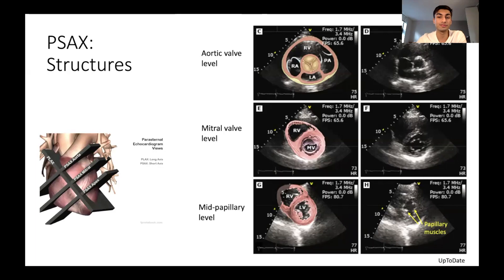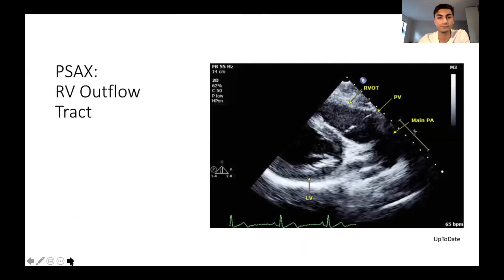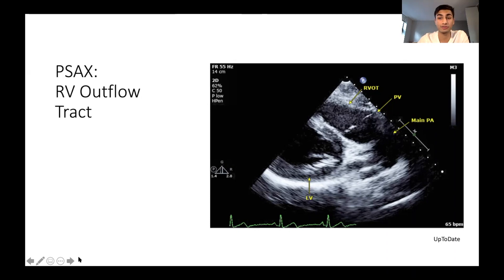Moving into the parasternal short axis views: first, at the aortic valve level — more towards the base of the heart — we're able to visualize different structures, with the important one being the aortic valve. Then at the mitral valve level, we can see where the mitral valve corresponds. At the mid-papillary level, you're able to visualize the papillary muscles. One other important view with the parasternal short axis is the right ventricular outflow tract, which is important for seeing how blood is flowing into the pulmonary artery — showing the RVOT, pulmonary valve, and the main pulmonary artery.